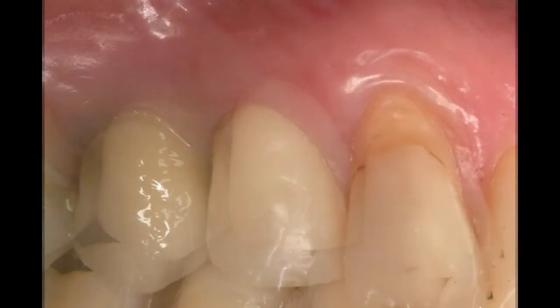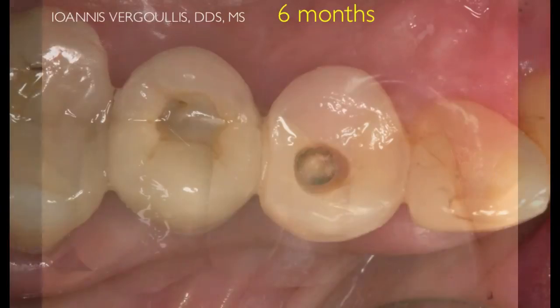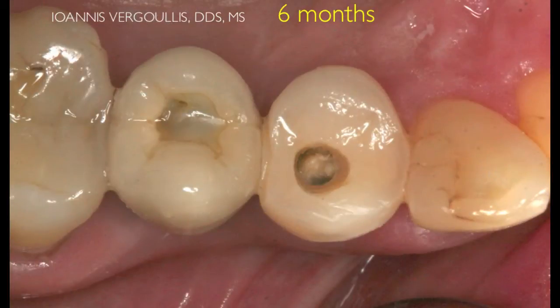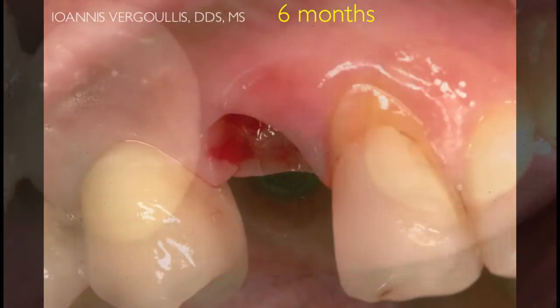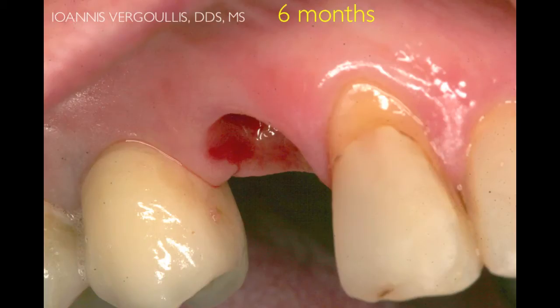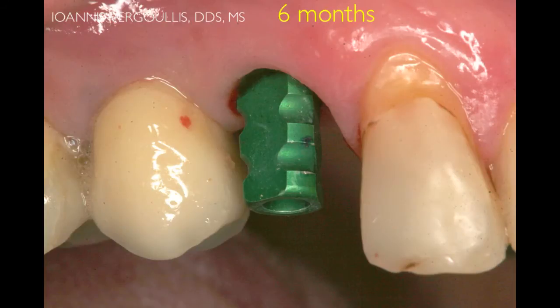Six months later, we can proceed with the fabrication of the final crown, so we will remove the temporary crown and take a new impression in order to fabricate the final crown. As you can see, we have been able to create a nice soft tissue profile. The presence of bleeding indicates the presence of hemidesmosomes, thus attachment of the soft tissue around the temporary crown.